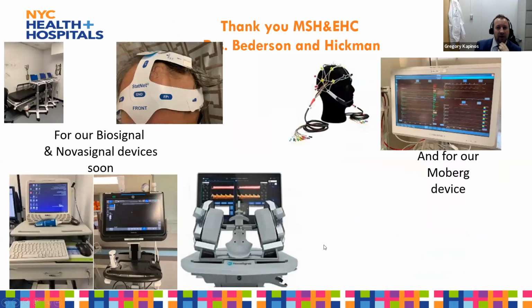And I want to thank Mount Sinai Hospital and Elmhurst leadership for providing us at Elmhurst with the technology that we need to ascertain those patients from different angles. Thank you to all our leadership about the biosignal, which is an EEG technology, and I hope to get soon also continuous TCDs with the Nova Signal device, which is right in the middle right there. And all of this will only make sense if we plug it to our Moberg, which is on the right, where we try to look at trends and correlation coefficients.